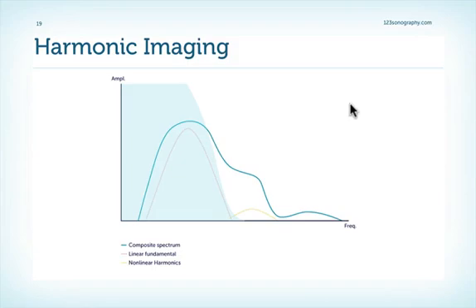But now it's time that we go to the ultrasound machine, where I would like to show you exactly what the influence of harmonic imaging and the imaging frequency on the quality of the 2D image is.